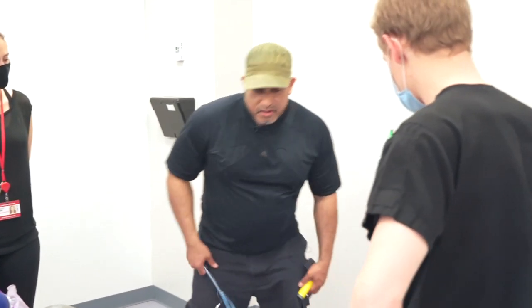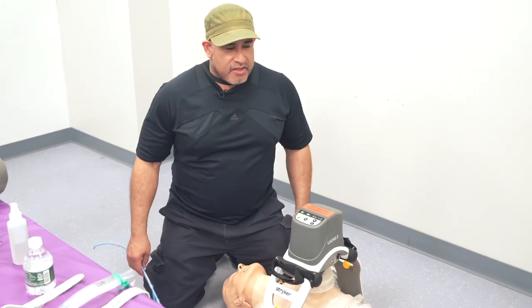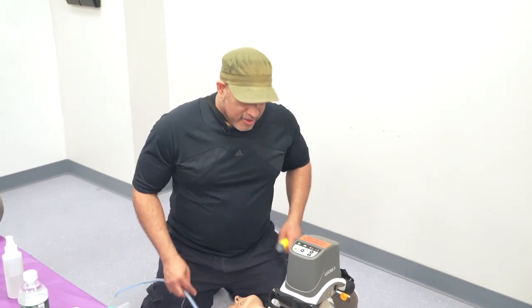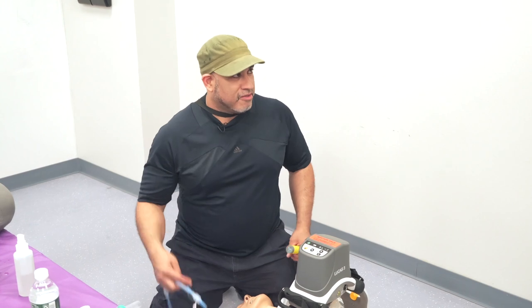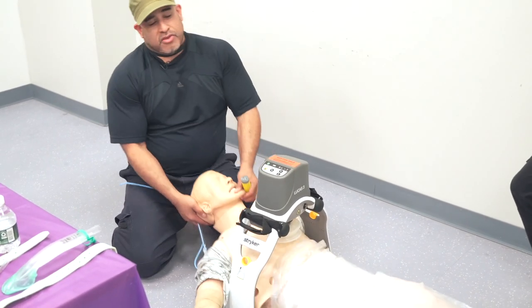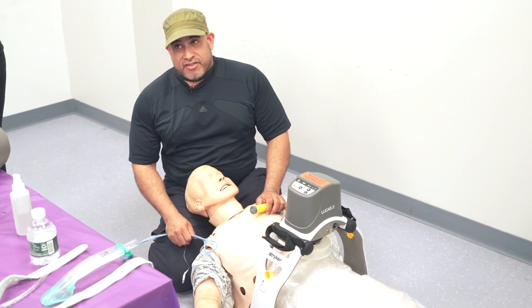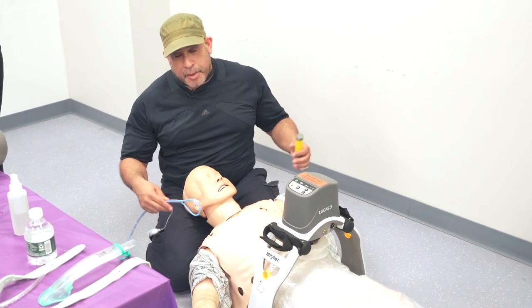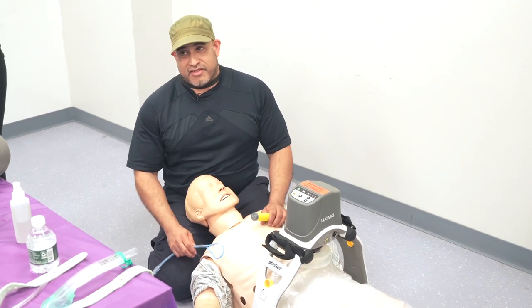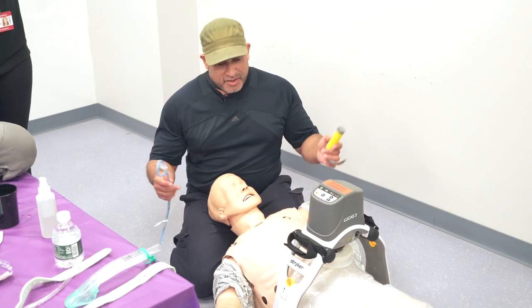The last technique is called the mother's caress. And the reason is because it's personal. You bring the patient's head and torso to your thigh. Only a mother would, regardless of what happens to this patient, do this. So that's why it's a mother's embrace or caress.